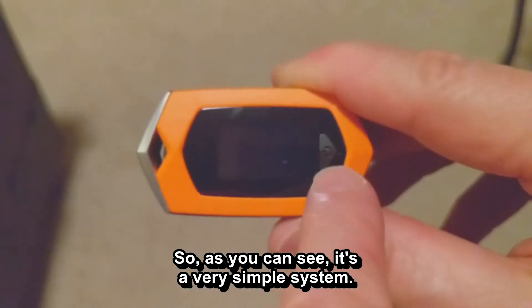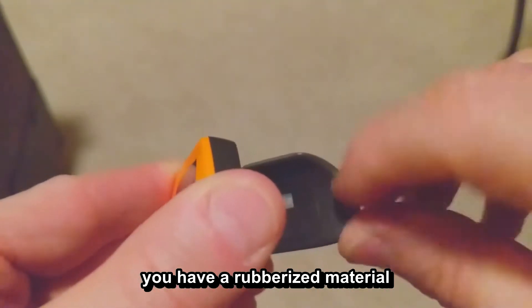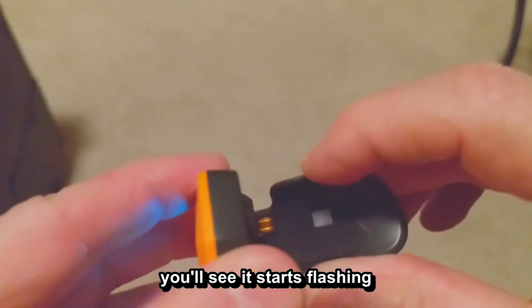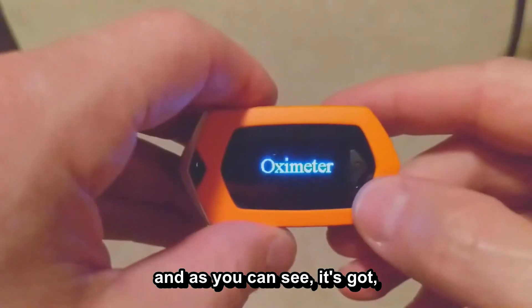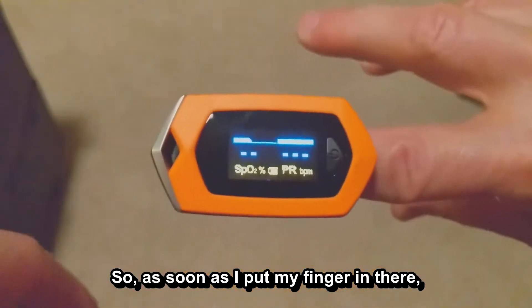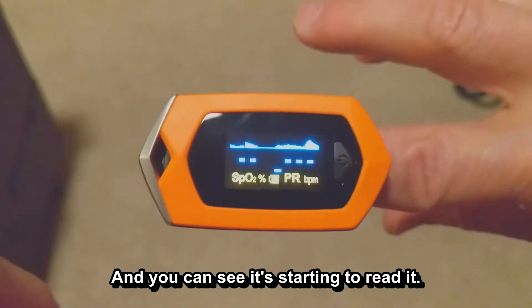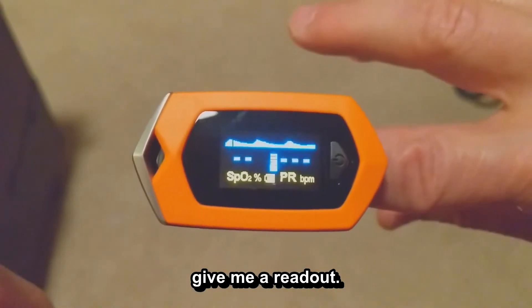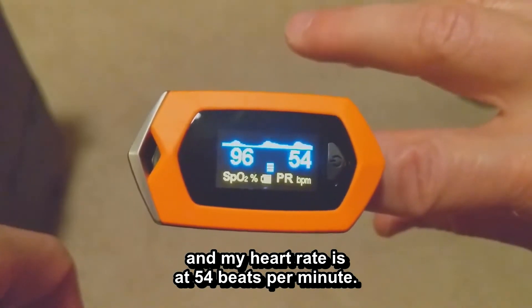It's a very simple system — it uses just one button to turn on and also to change the settings. There's a rubberized material on the inside bottom and on the top. When you turn it on, it starts flashing to get a readout of your pulse. You can see it says 'oximeter,' and then you've got your SPO2 and your PR beats per minute. As soon as I put my finger in, it takes about 8 to 10 seconds and it starts reading and showing my heartbeat. Now it's at 96 and my heart rate is at 54 beats per minute.